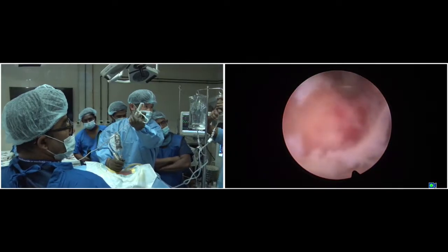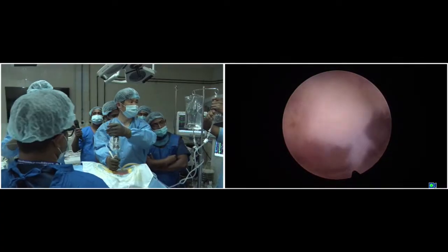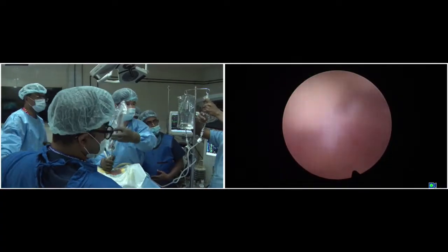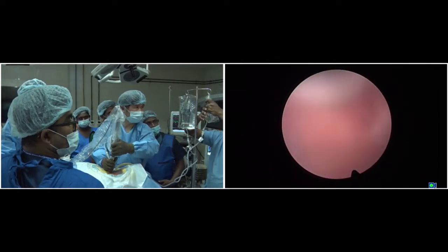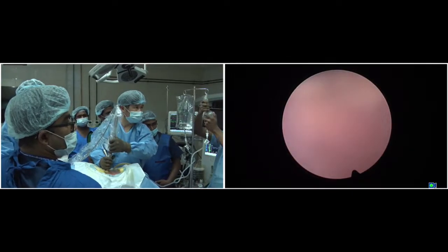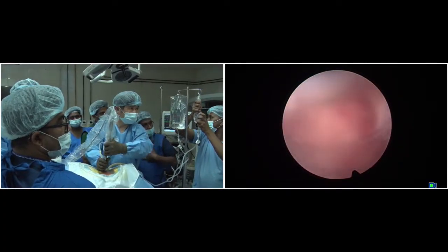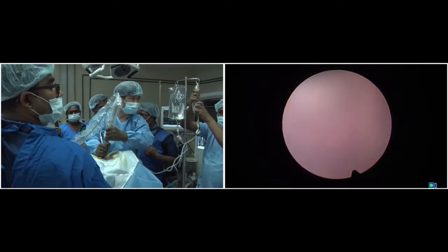Here is a low pedicle here. Normally it sometimes needs some drilling. To make a sufficient space, it may need some pediculotomy like this way.